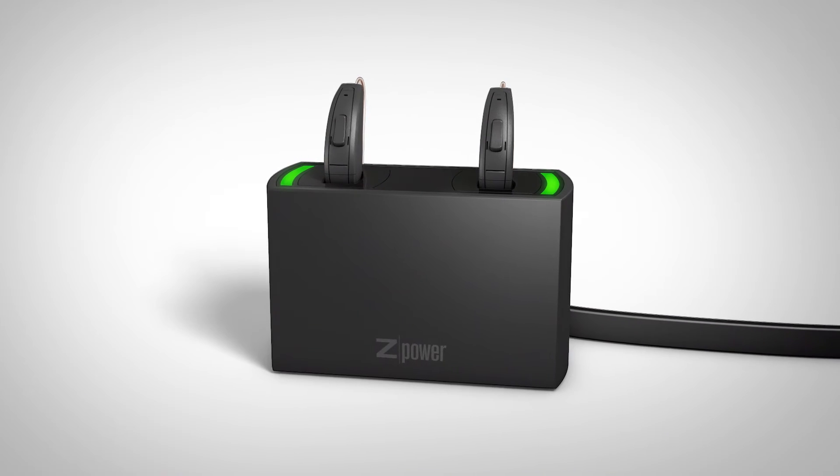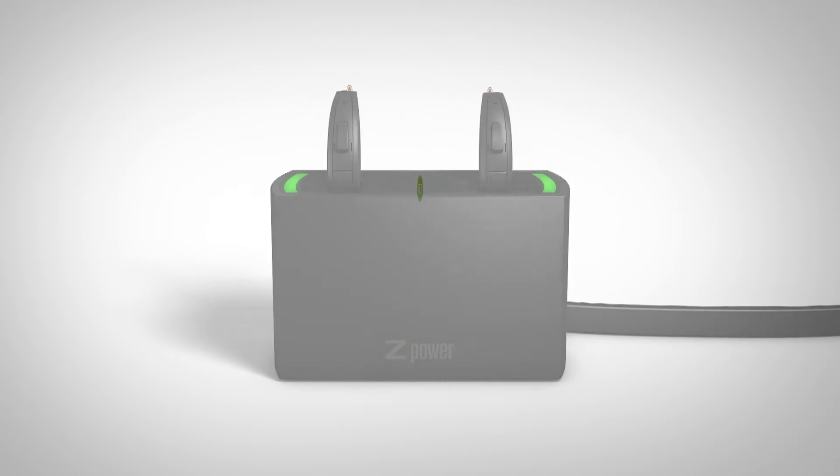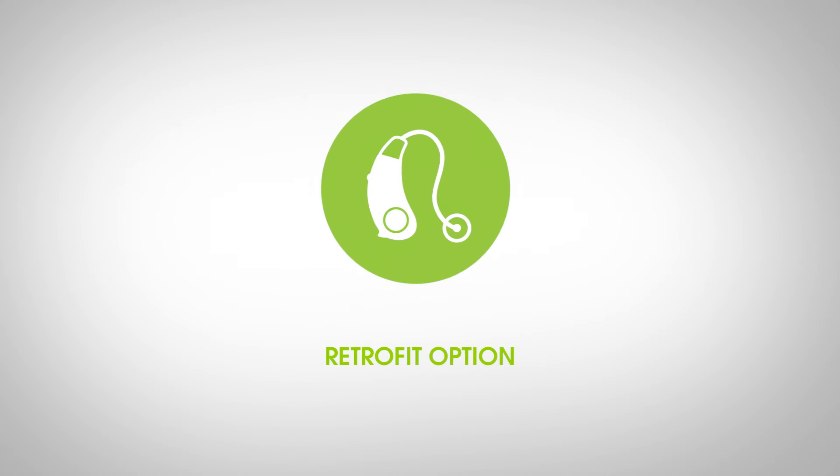The Z-Power rechargeable system delivers what patients want in today's most sophisticated hearing aids: confidence and convenience, all-day power, interchangeable with traditional zinc air batteries, and able to be retrofit onto current hearing aids.